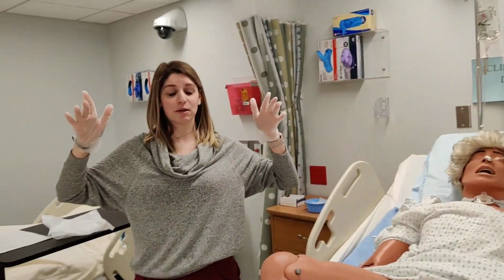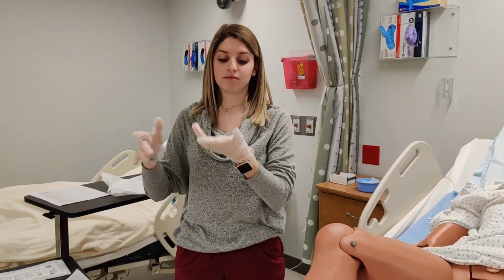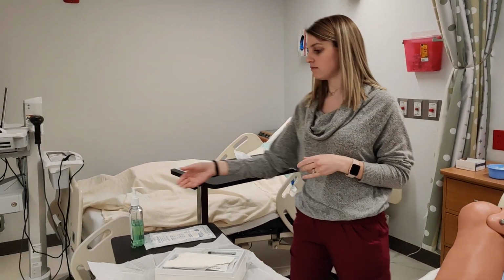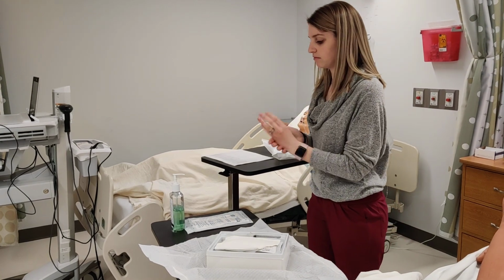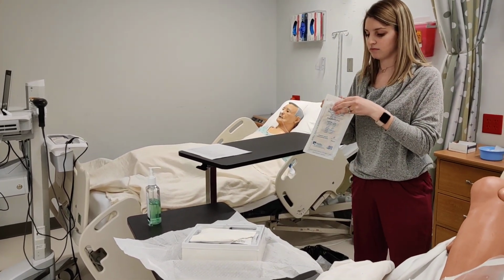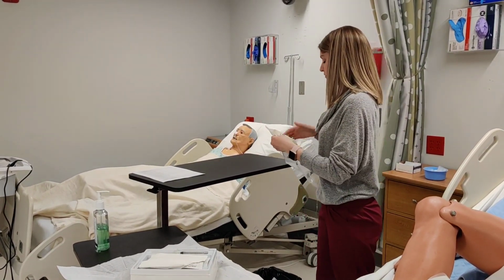So guys, learning point, that's why I bring an extra set of gloves with me. Because if I contaminate, I can take these off and I can now put on my new sterile gloves. Okay? So I'm going to do that. And remember, whenever you're removing gloves, you have to wash your hands in between, even if you're putting a new pair of gloves back on.